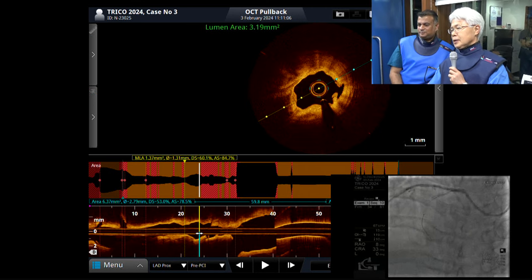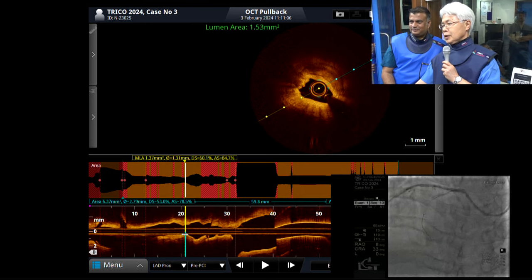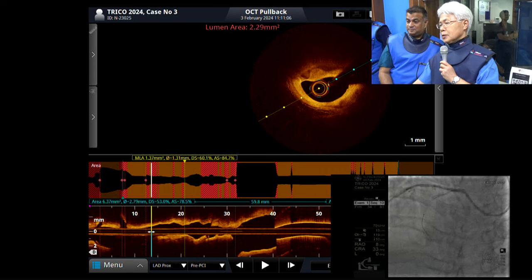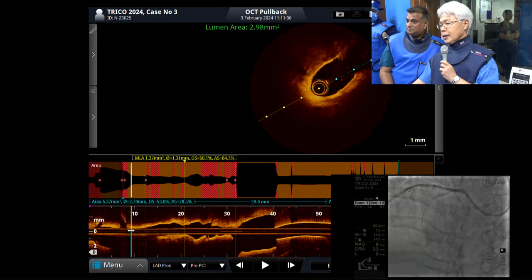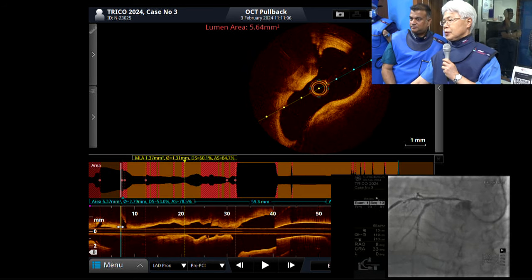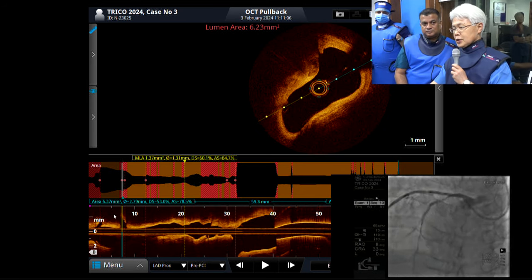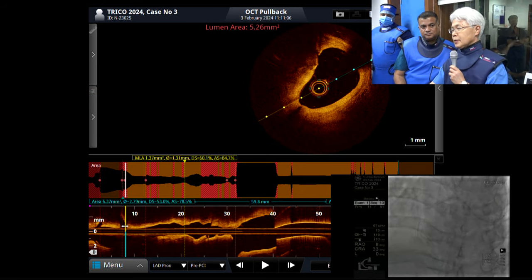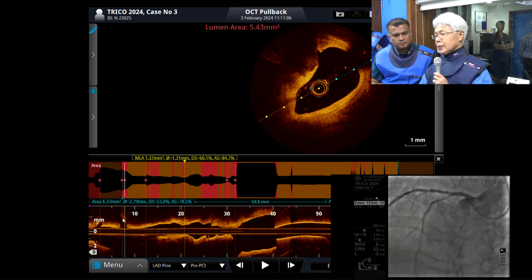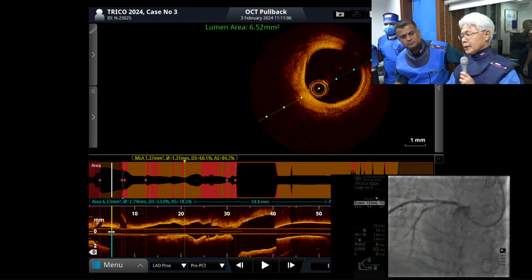And here, the distal also has 180 degrees, very eccentric, septal. And then, 2.5 or 3 IVL? 3. 3 millimeter IVL. Here is a branch. And we have some nodular calcium. Now, Professor, I have a question for you.